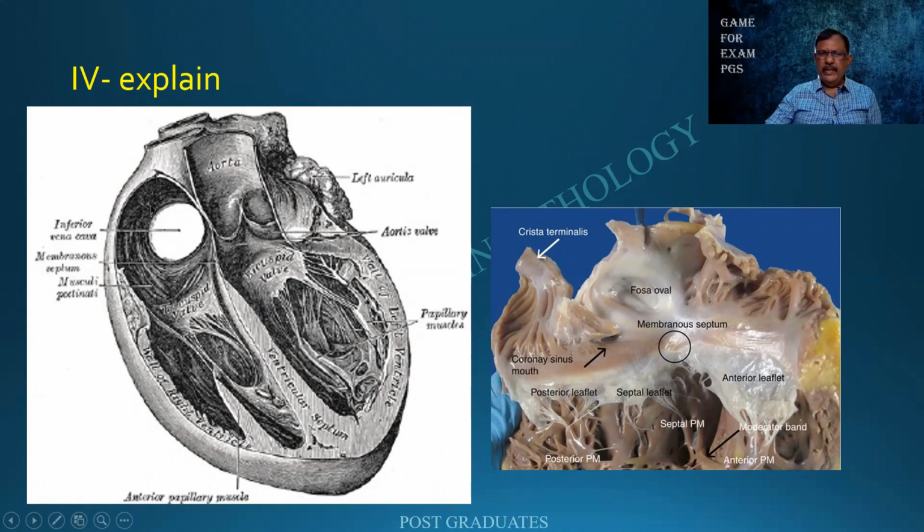Once again, I summarize. The right side of the heart is opened. Between the vena cava, there is an incision, and I will be able to look at the tricuspid valve and find out if there is any damage to it. Then the lateral border of the right ventricle, and finally through that the pulmonary artery is opened up. And on the left side, again the left atrium is opened. Open up the left ventricle, examine the mitral valve from above and below, and then open the aorta. Look at the cusps of the valves.